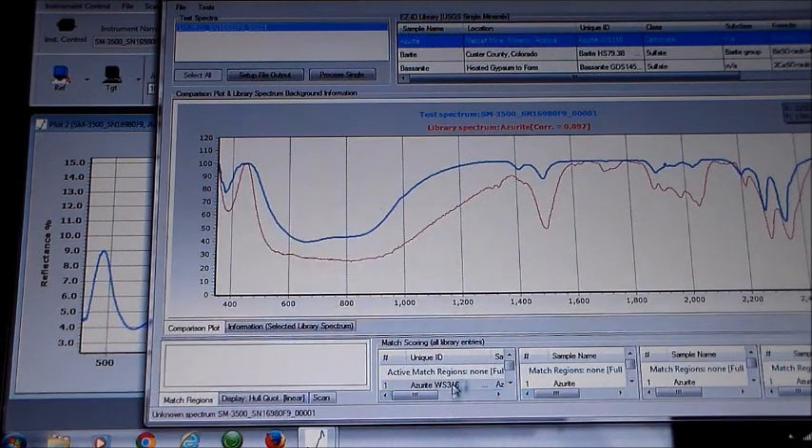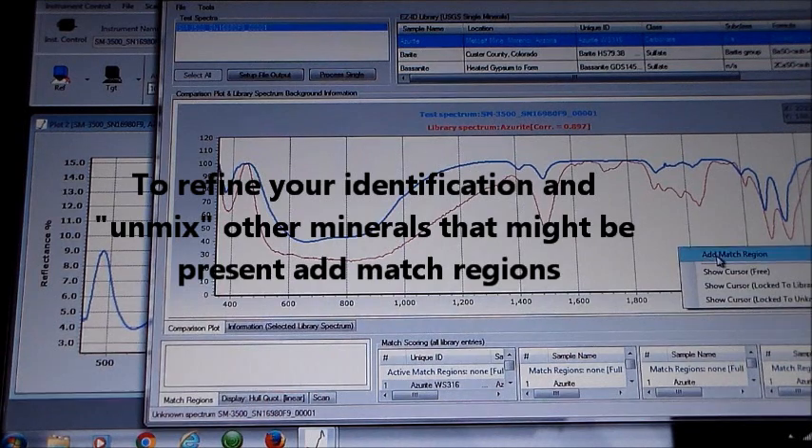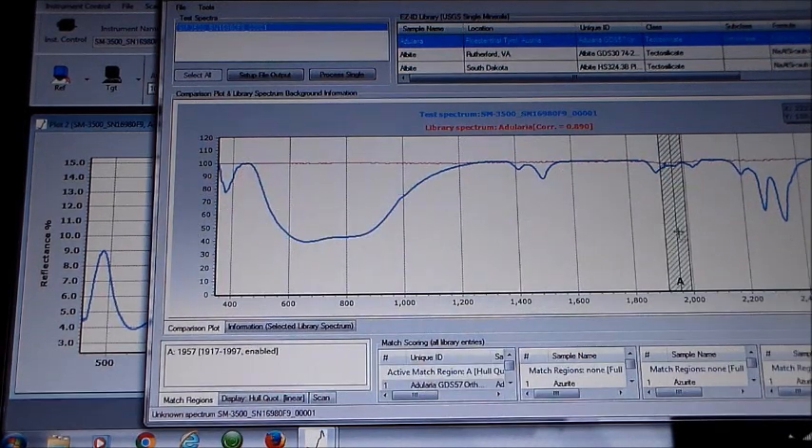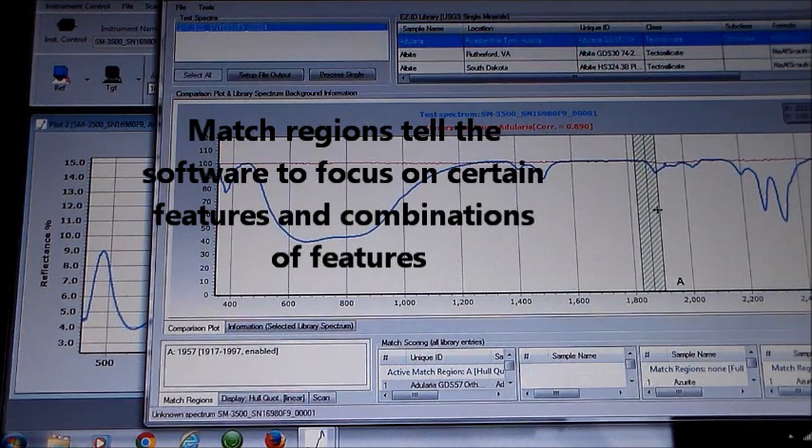The full scan matches best to a sample of azurite in the library. Further identification and unmixing of other minerals that might be present can be accomplished by creating match regions. Match regions tell the software to focus only on certain absorption features for matching.